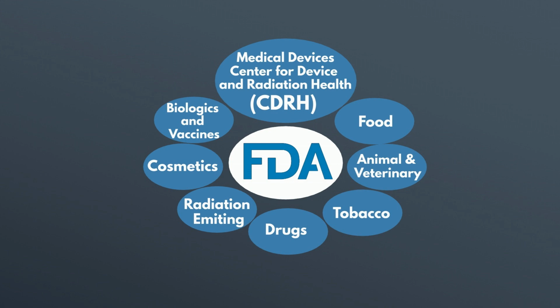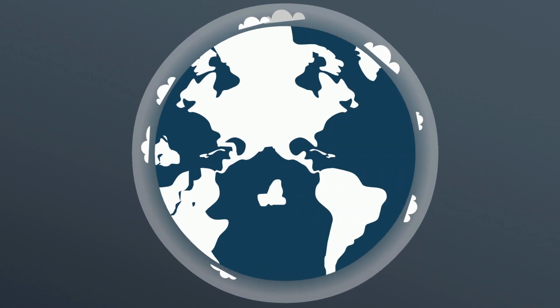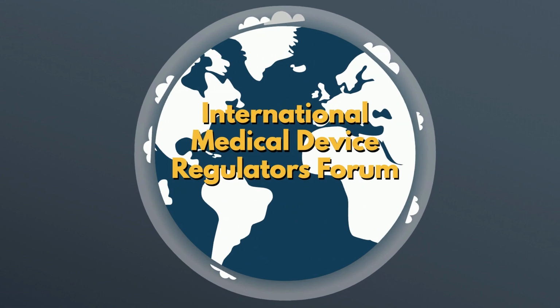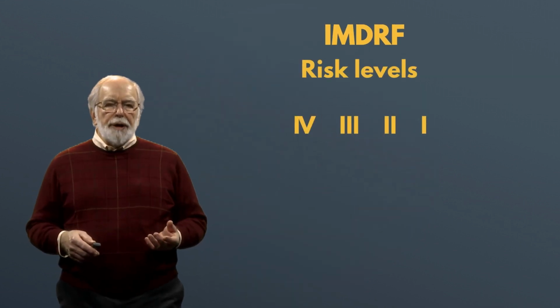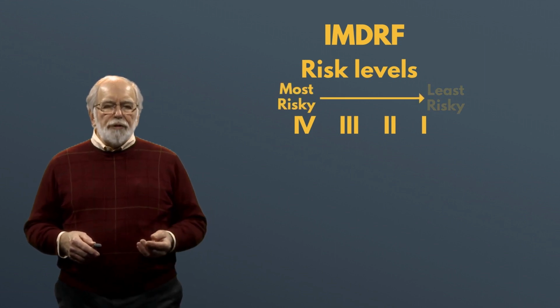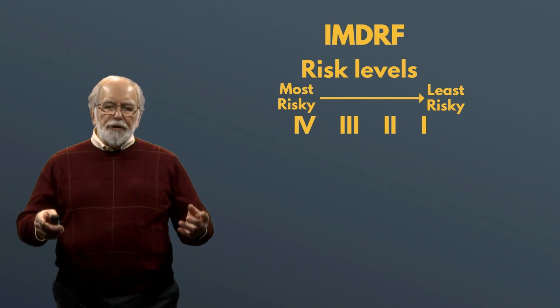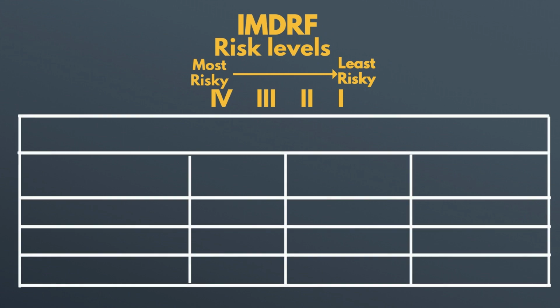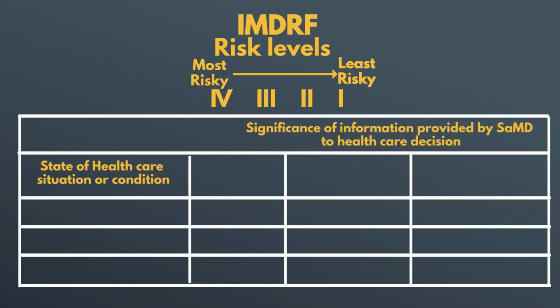But since this is a relatively new area, CDRH partnered with global regulatory agencies from around the world to create the International Medical Device Regulators Forum, or IMDRF. And IMDRF created 4 categories of risk levels for SaMD products, where 4 is the most risky and 1 is the least risky. And with these different categorizations, they looked at different applications for SaMD products and evaluated the criticality of the device, so either critical, serious, or non-serious.